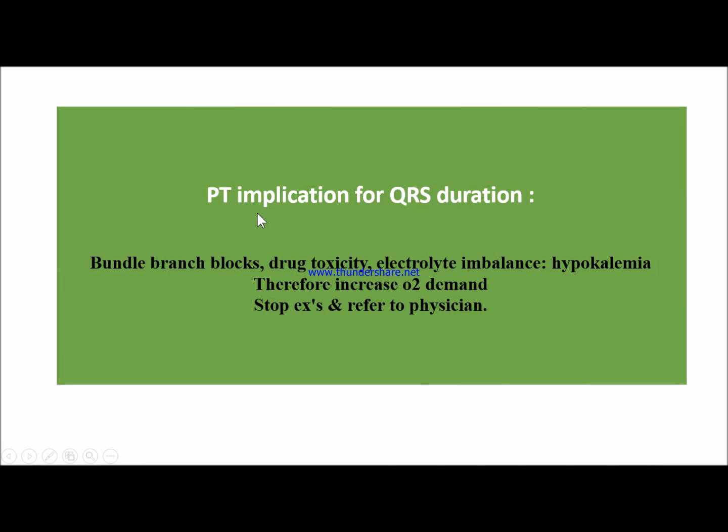Let's see the physiotherapeutic implication for the QRS duration. It is due to the right and left bundle branch block, drug toxicity or hypokalemia. So there will be less oxygen and increased demand. So we have to stop exercise and refer them to the physician, because a physiotherapist cannot prescribe oxygen to the patient, and this is the duty of the physician. So we have to refer them and stop the exercise, because if they feel more dizzy or more breathless, it will be a complication for the patient.